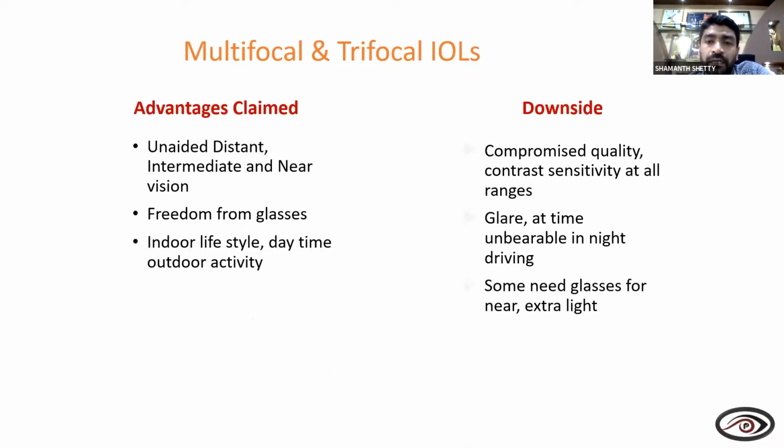I've already spoken about the advantages of multifocal and trifocals, but there is a downside. The number one downside of multifocals and trifocals is the glare associated with them. Some patients do come back and say that the glare is unbearable.